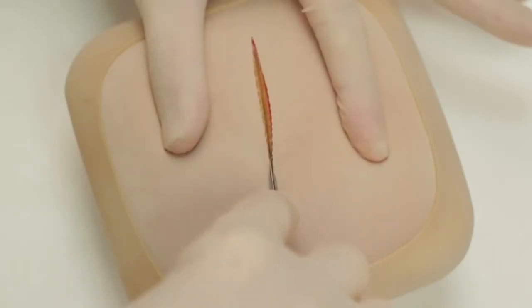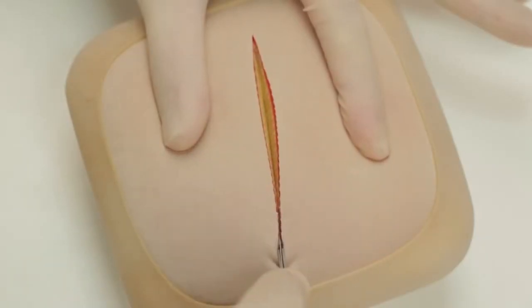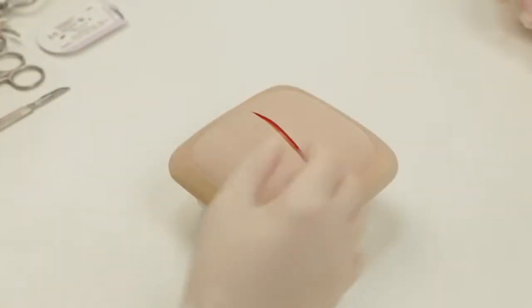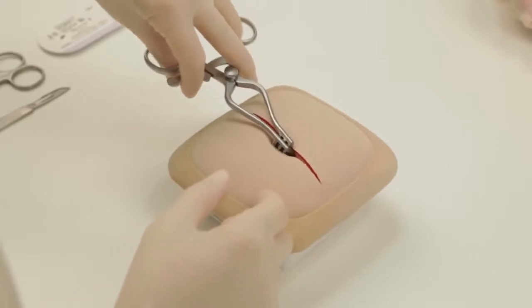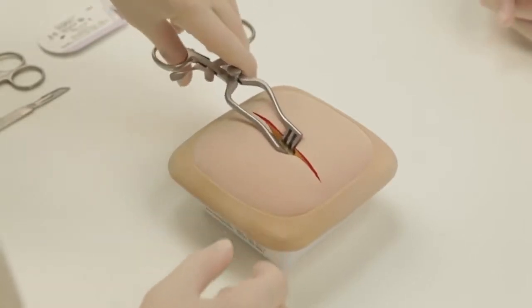The skin is incised with the belly of the knife. Next, divide the subcutaneous fat, Scarpa's fascia, and underlying tissue to expose the external oblique aponeurosis.